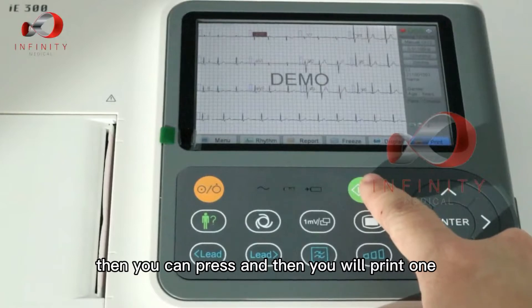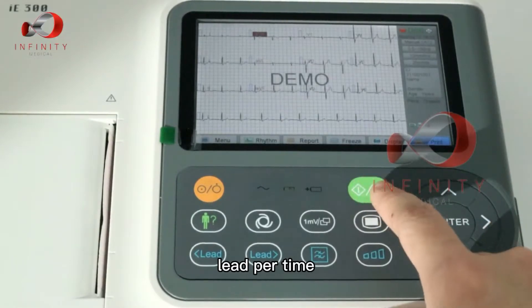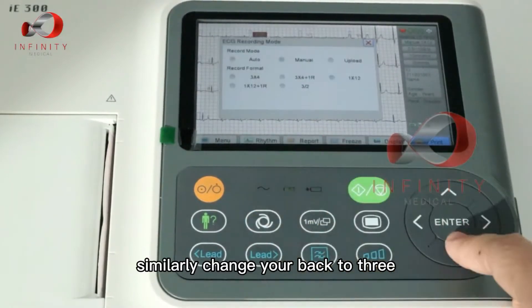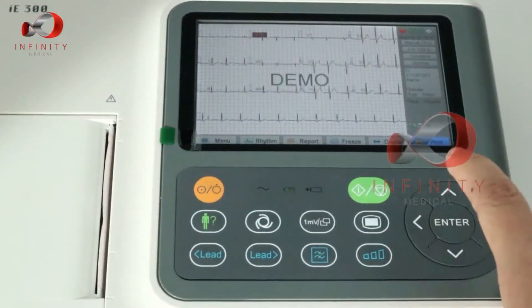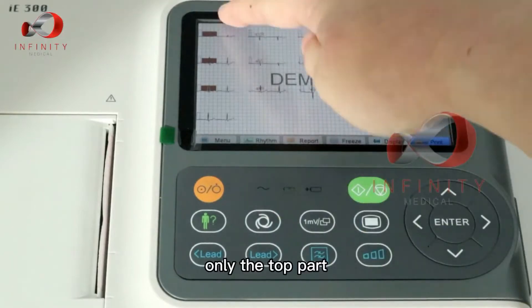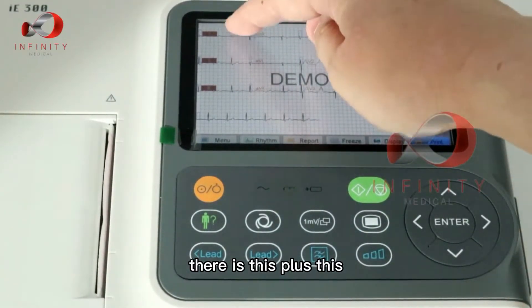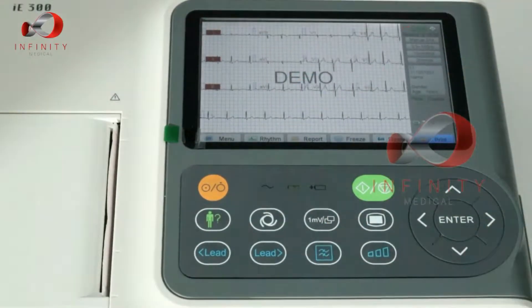Press print and it will print one lead at a time. If you want to print three leads at a time, change it back to three. Three times four covers only the top part, and three times four plus one rhythm adds the rhythm strip below.